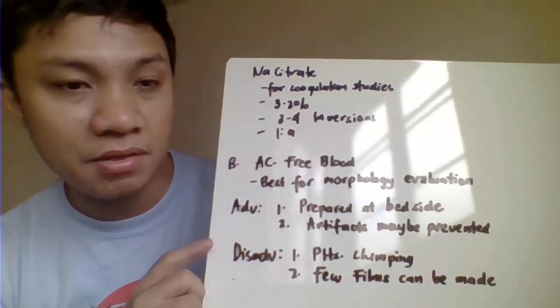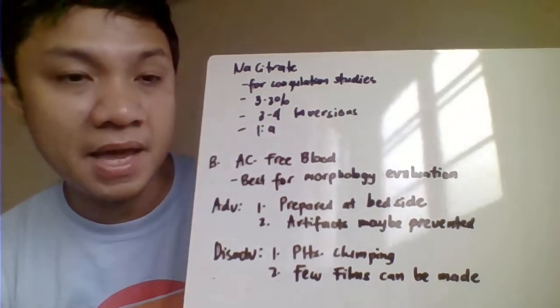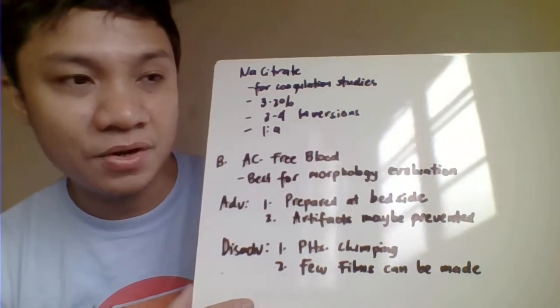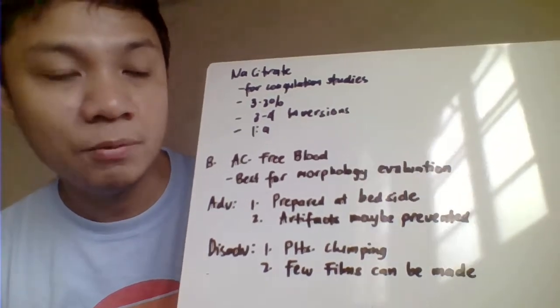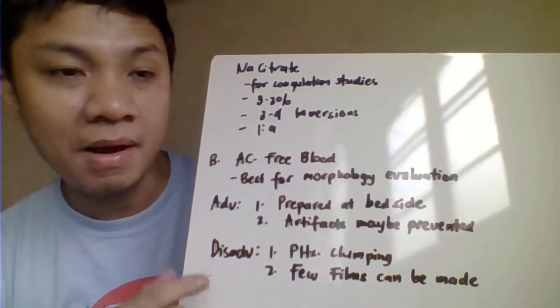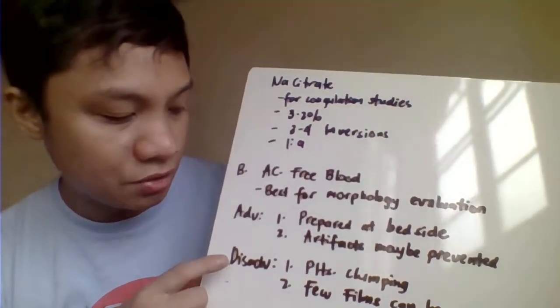So, you could prepare your blood film at the patient's bedside. So, when you go to the patient, then collect the blood, immediately you're able to make a film upon the collection process. The advantage of that, less error with the patient identification. Okay, so unlike, right, when you collect blood in EDTA, it is brought to the laboratory, and only then do you make the film, and there would be a tendency that the blood is not from the patient. But this one, since you collect it at the patient's bedside, automatically, after making a film, you label that one, so less chance of error in the patient identification.